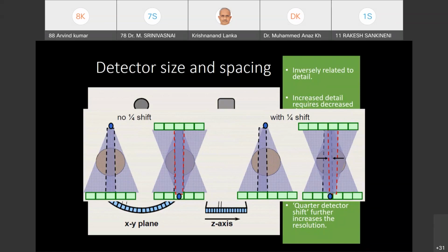All right. So using, say, the current and then field of view, FOV kind of parameters. All right. So similarly here, previously people used to do a lot of PhD work in this, but I think now it is a matured subject and most of the things are being done by the intelligence of the machine itself, instead of human intervention in increasing the sharpness of the image.